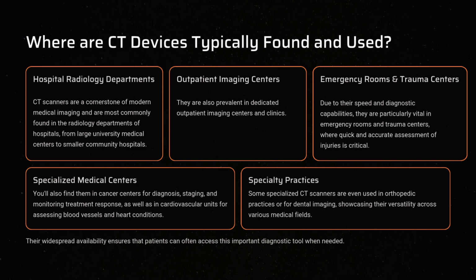Where are CT devices typically found and used? You might be wondering, where are these essential CT devices typically located and utilized? CT scanners are a cornerstone of modern medical imaging and are most commonly found in the radiology departments of hospitals, from large university medical centers to smaller community hospitals. They are also prevalent in dedicated outpatient imaging centers and clinics.